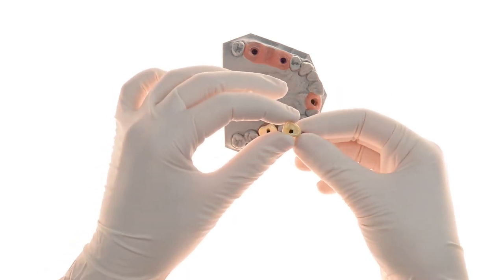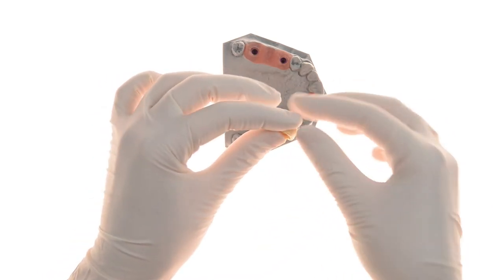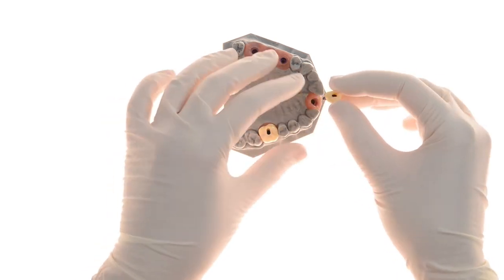Once the restoration is milled, the screw is positioned inside the adjustable EasyBase. Then the restoration is cemented to it.